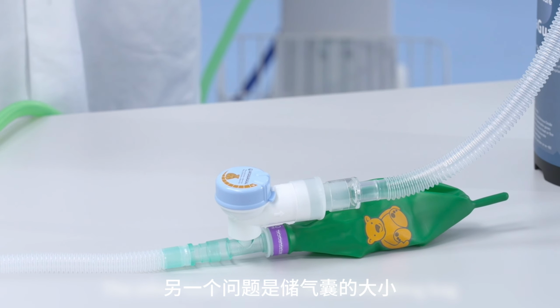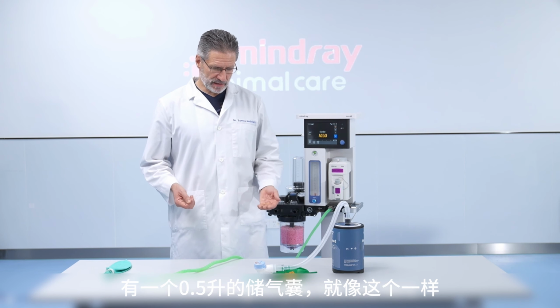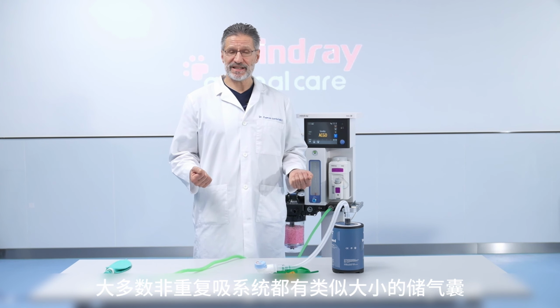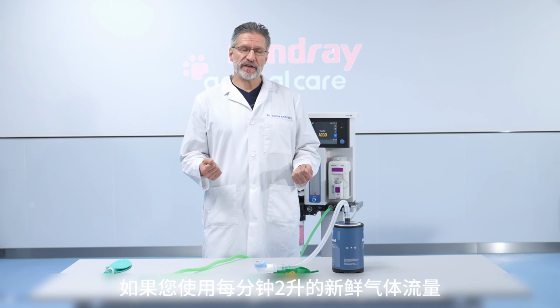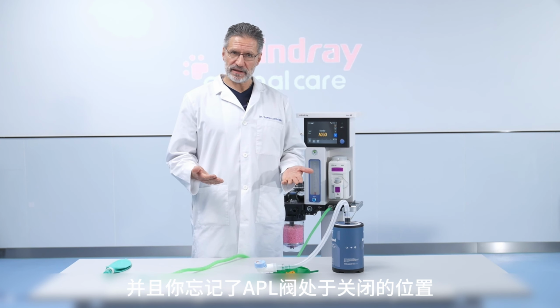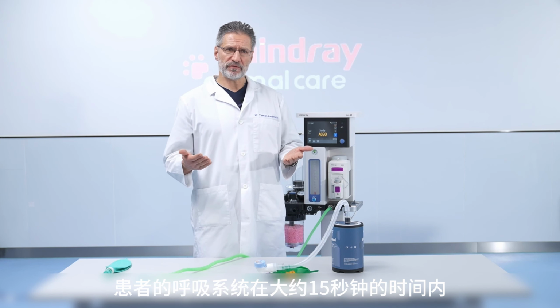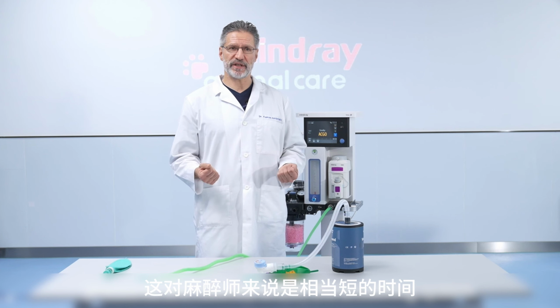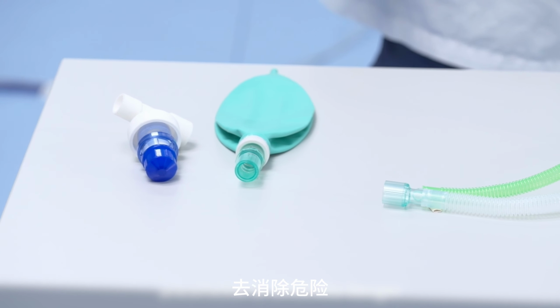The other issue is the size of the breathing bag. If your non-rebreathing system has a half-liter bag, such as this one here, and most of the non-rebreathing systems have a similarly small bag, and you use a fresh gas flow of 2 liters per minute and you forget the APL valve in closed position, the patient has about 15 seconds until dangerously high pressures are reached within the breathing system. This is a rather short time for an anesthetist to eliminate a danger.